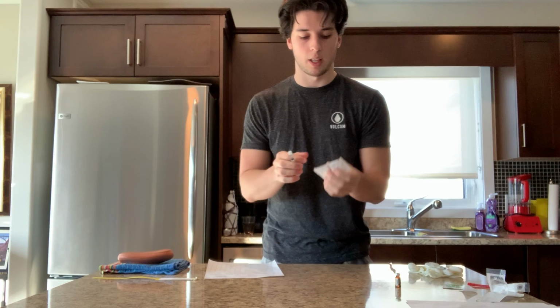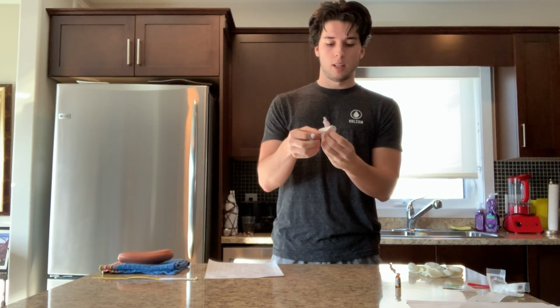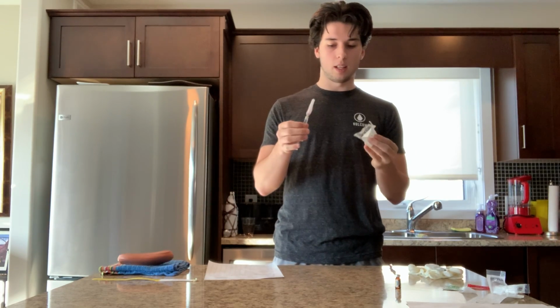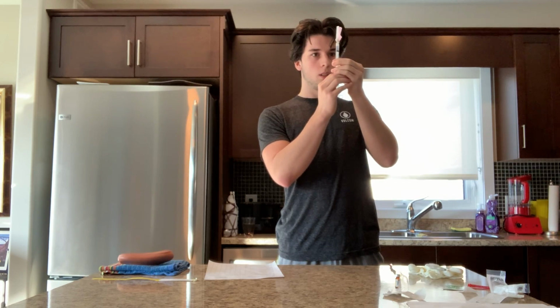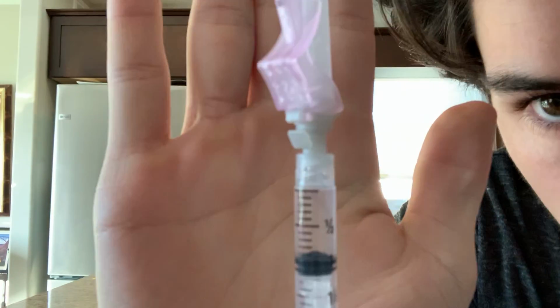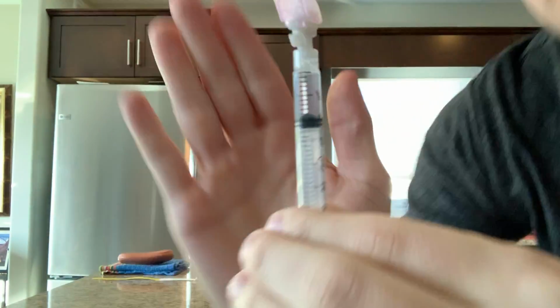So I'm going to grab my subcutaneous injection needle here and open it. And then I'm going to attach the two. Perfect. And now that I have attached the two, I can now prime the needle. So I'm going to prime it up just so we see a little bleb at the top, and we have the exact desired 1 milliliter that we want. So there we have a little bleb. And here we have the exact 1 milliliter that is required in the syringe with no bubbles.